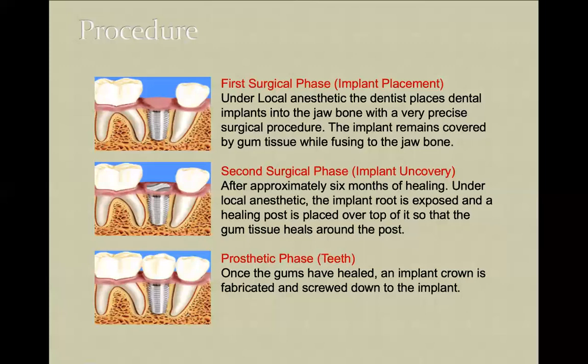Again, we did our elucidation, we did our preparations. We are doing local anesthesia only. I'm not talking about sinus lift. I'm not talking about grafting. Single dental implant placement. Local anesthesia only. No blocks. Not necessary and not even helpful.